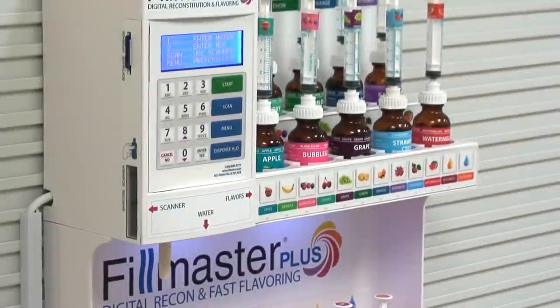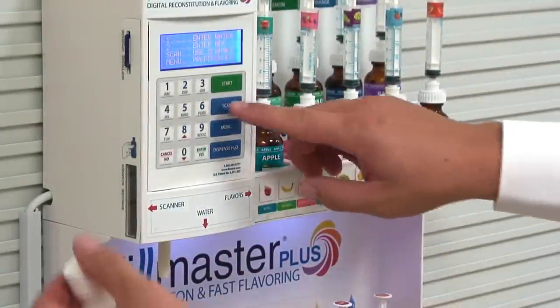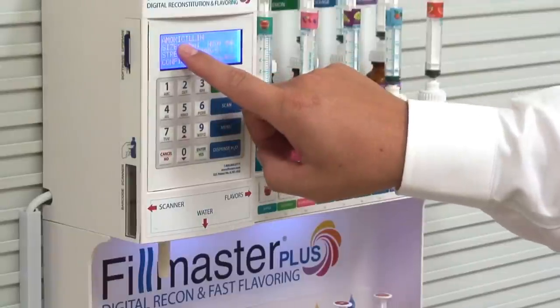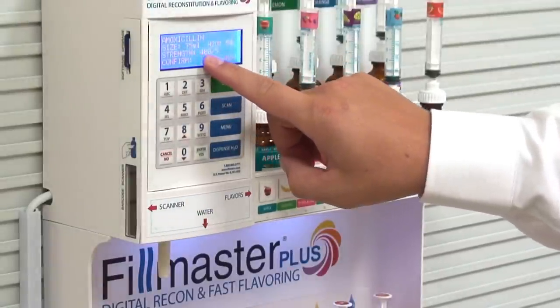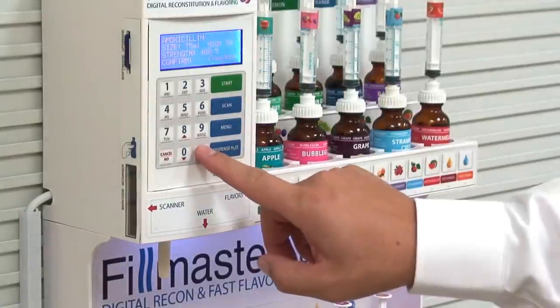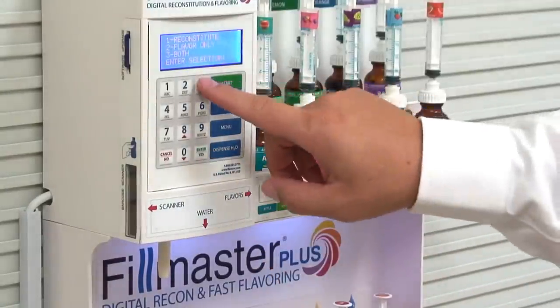The Filmaster Plus makes reconstitution and flavoring fast and easy. To begin, press scan to scan the barcode of the medication you'd like to reconstitute and flavor. The system lists the drug name, volume, and strength to confirm you're dispensing and flavoring the prescribed medication. Press yes to continue. Press 3 to reconstitute and flavor.